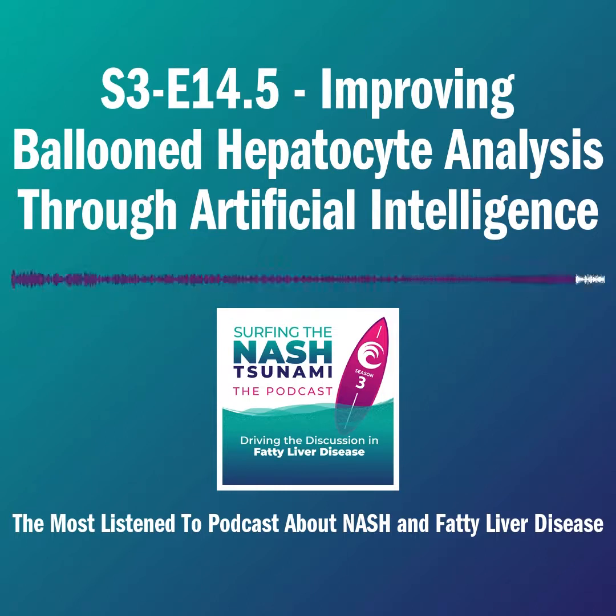But in fact, what's being described is morphology. We've been talking about the perisinusoidal fibrosis. So it's really to actually enable you to quantify morphology, which was really the intention of the system at that time. So this is another level which I think we need to put a lot more effort into, because right now the whole 1 point reduction is actually a consequence of that. But the fact is that we see the features reduction, which we don't say anything about.